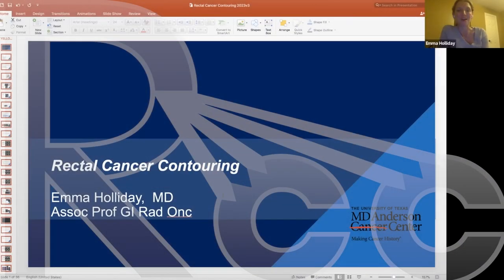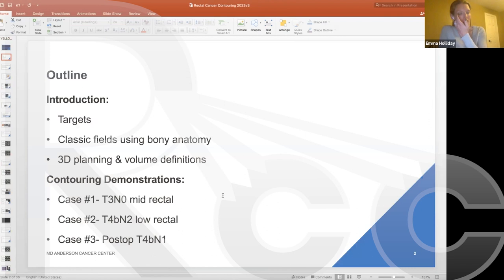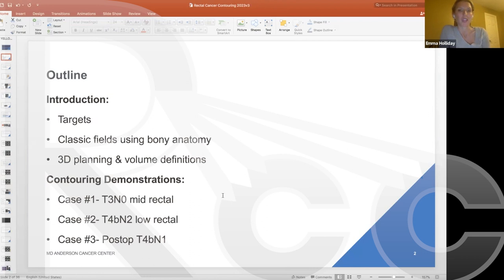I've been tasked with presenting some common mistakes, tips, and tricks on rectal cancer contouring. I've included a couple cases today — one in the preoperative setting and one in the postoperative setting. Here's what I hope to cover in this approximately 50-55 minute session: as part of some introductory materials, we'll cover the targets that are important when planning a case for rectal cancer.